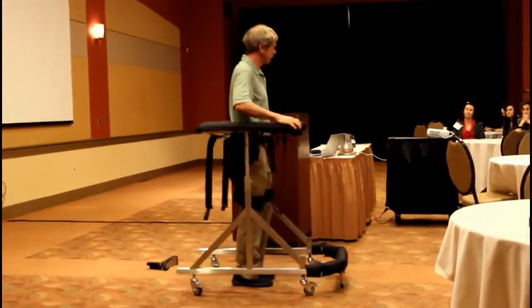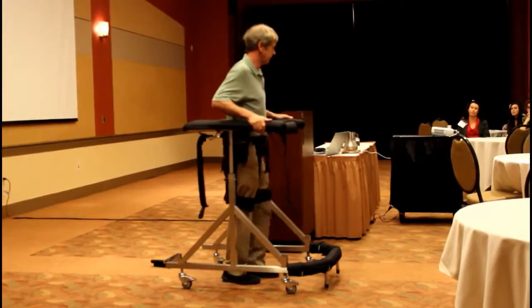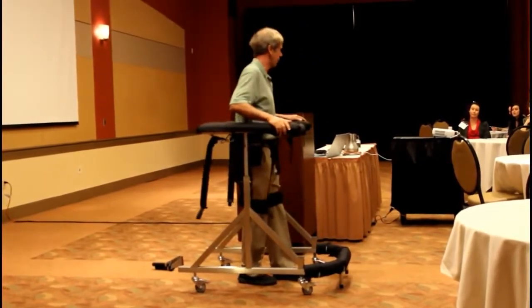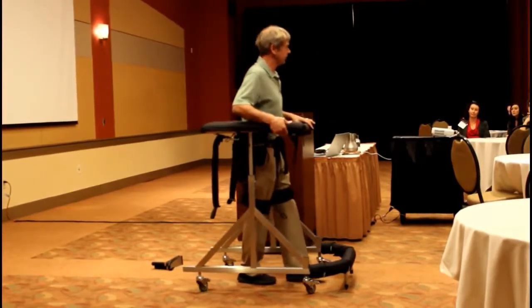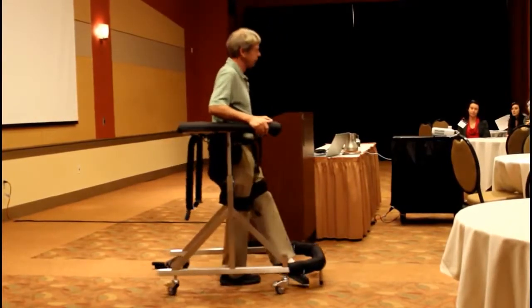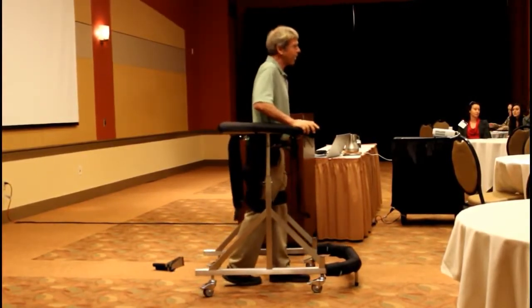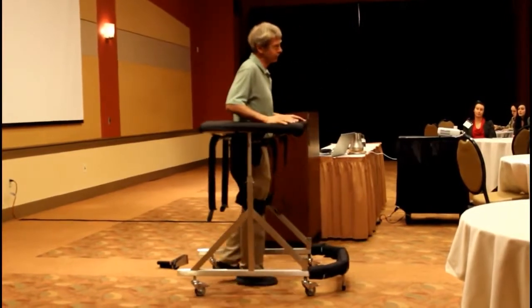And if you want to disengage the weight, you simply turn the person around and have them face the open side, and then that would disengage the brake, and then you could just step on the front, which becomes the back. That would allow you to, if someone's a real leaner in their initial sessions. And actually, it's a good benefit to have the braking system where they're facing the front. If you're trying to work with someone and they're leaning, that's not something you really want them to do anyway. So it reminds somebody very quickly, if they're leaning and it's not going forward, maybe their posture needs some work.